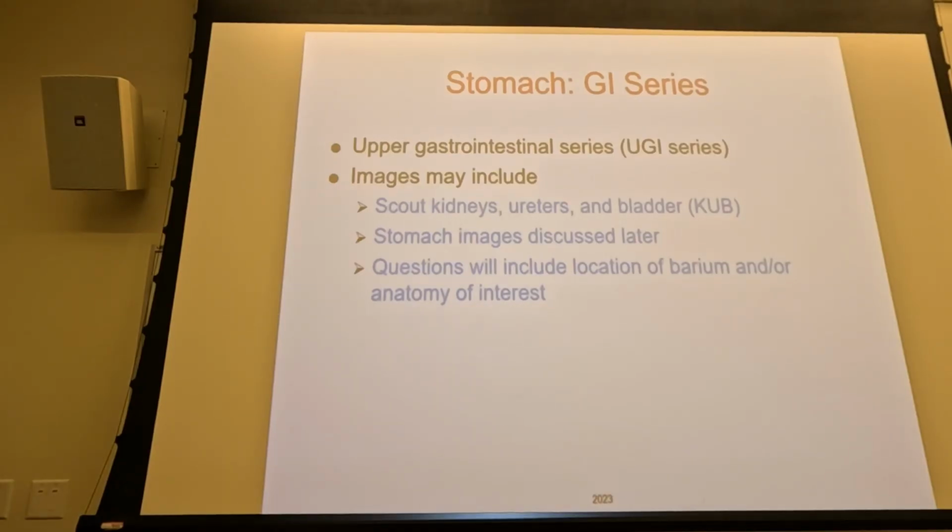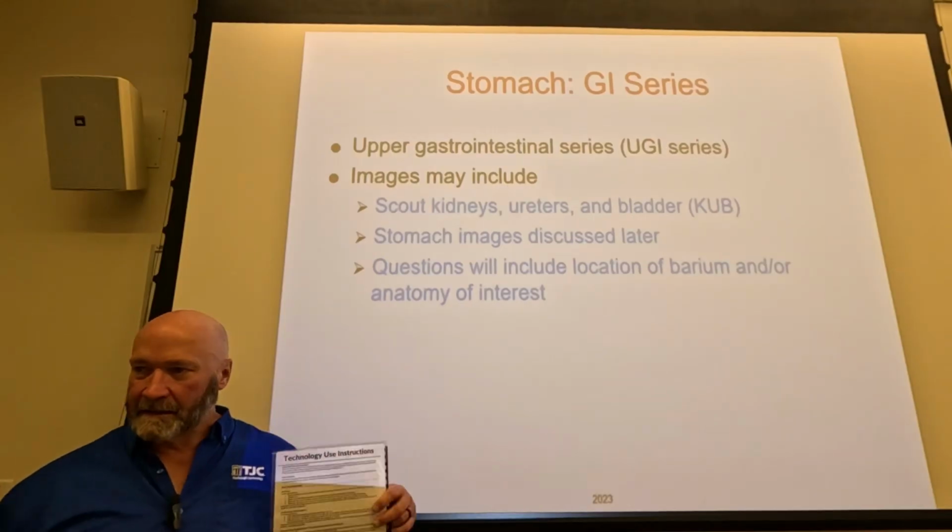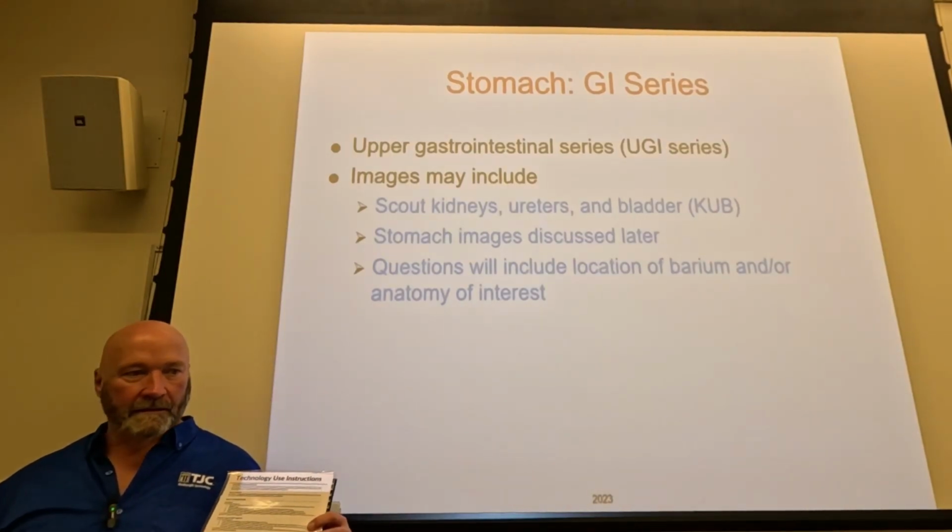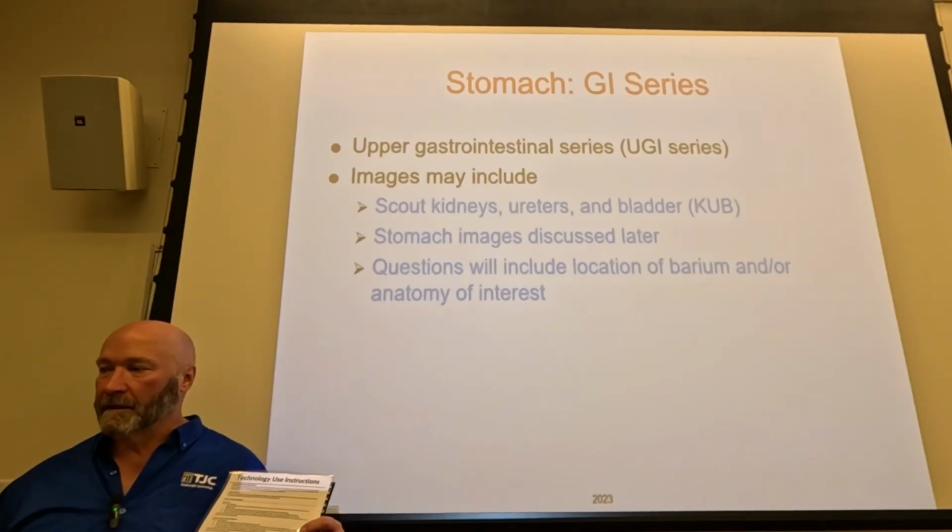gravity. Because what's going to happen if you've got this thick barium and you've got air? Where's the air going to go? Up. And the barium's going to go down. So a working understanding of how the stomach is situated inside the patient's body is important. The stomach is not just straight up and down like this. The upper portion of the stomach is posterior.